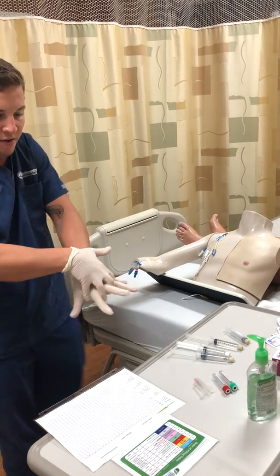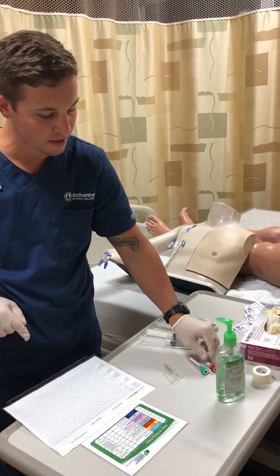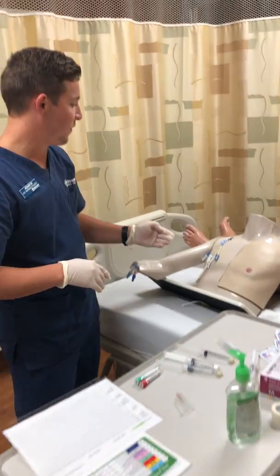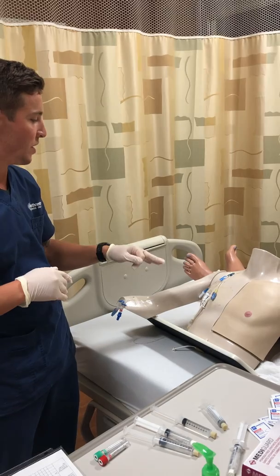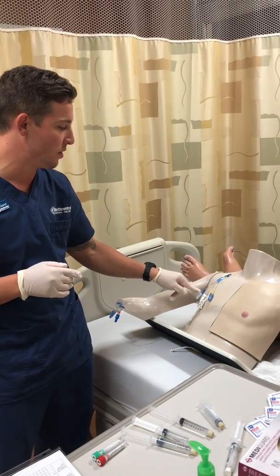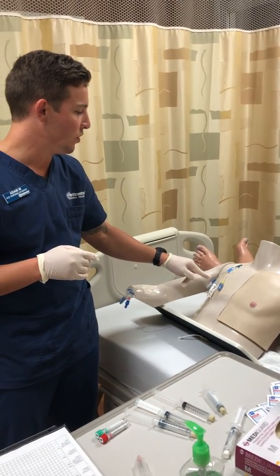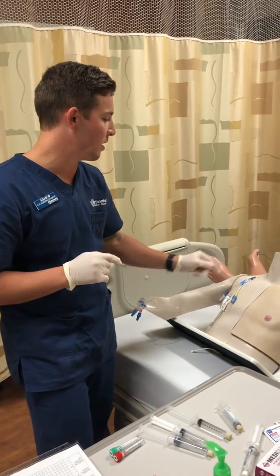So I see on here with my order of filling tubes, I'm going to want to do red first, then mint. Okay. So I'm going to be doing this off of a central line. Here she has three lumens here. So we're going to use the one that the facility wants for drawing blood. Here in this case will be our white here. You want to make sure that you have 4 French or greater. Make sure that it's big enough.